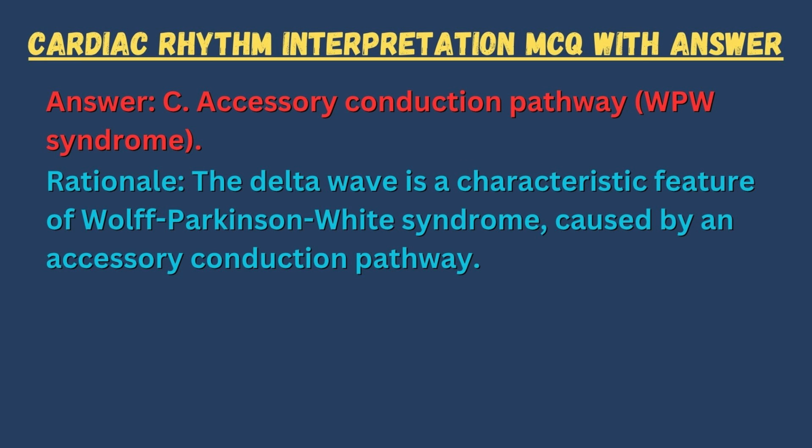Answer: C. Accessory conduction pathway, WPW syndrome. Rationale: the delta wave is a characteristic feature of Wolff-Parkinson-White syndrome, caused by an accessory conduction pathway.